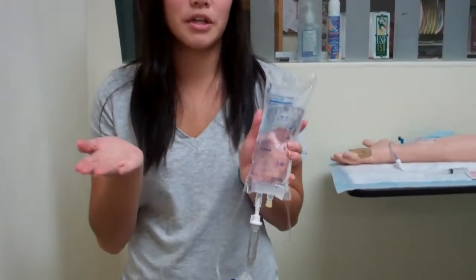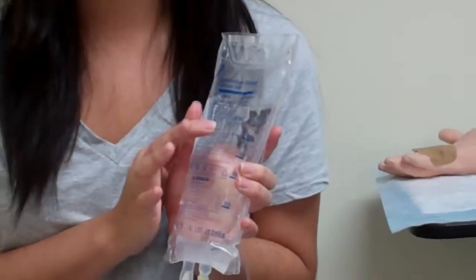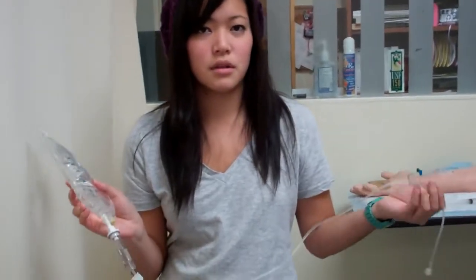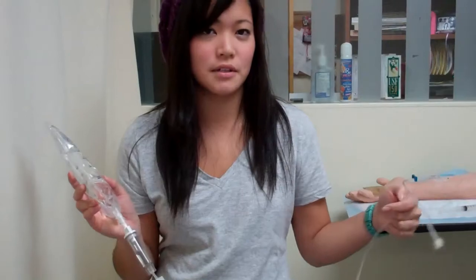So this is just my medication. I want to make sure that I have my medication bag labeled with the name of the drug, the dose, the time, and the volume to be infused. And the tubing, also make sure that it's labeled with my initials, the date, and the time, and it's good for 24 hours.